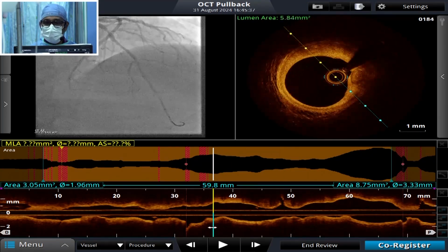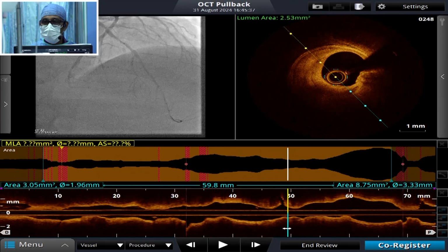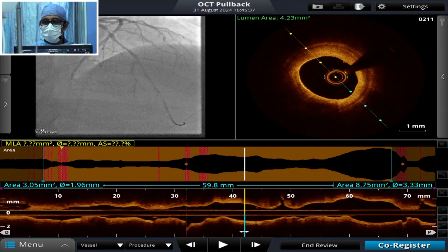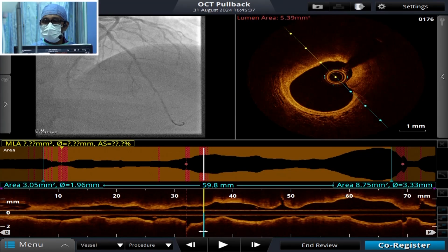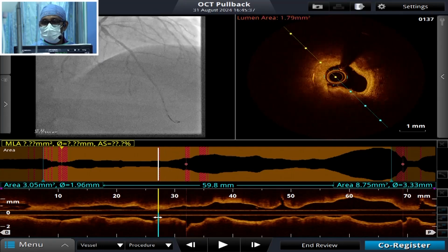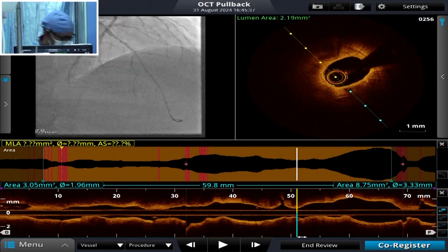And then as we go to the distal lesion, again here we can see that particular area from 12 o'clock to 1 o'clock position, this nodule has probably been shaved off. You can see that in the distal portion. Again, that sanding is seen clearly. As we go further distally, nothing much. So at least in one area we have seen that it's really done some benefit.